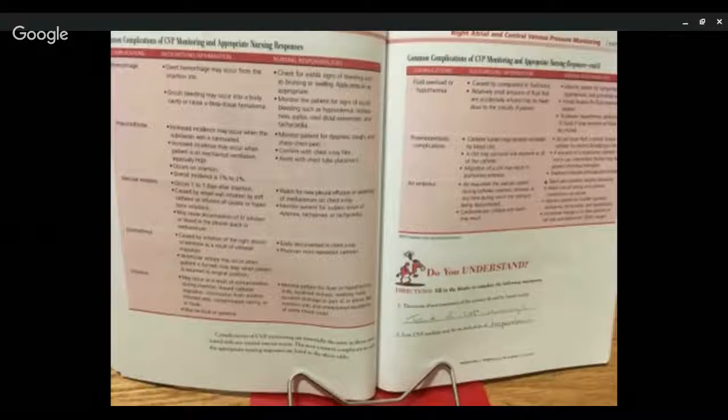Pneumothorax. If pneumothorax occurs with a CVP, it could be because of the procedure itself. Just the insertion of a CVP catheter caused a pneumothorax, which is pretty much a hole in the lung.